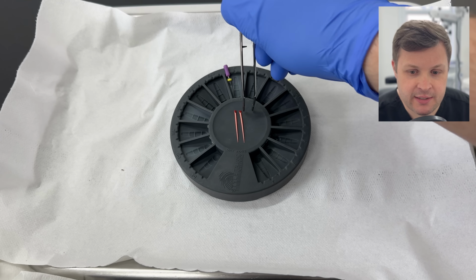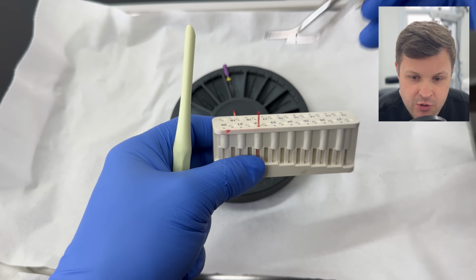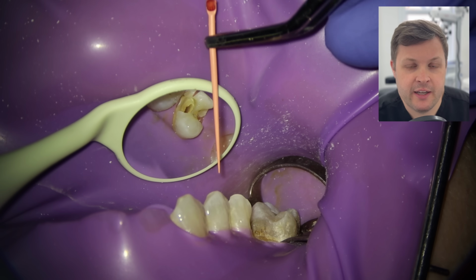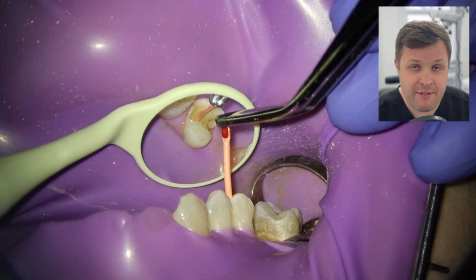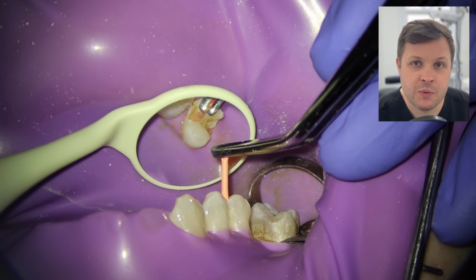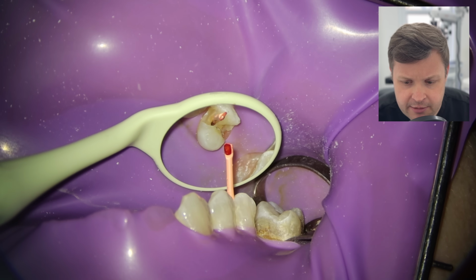And then we're going to pick up the cone. We're going to measure this cone 0.5 millimeters away from the 0 reading we found on the working length, which is about 22 millimeters. Then we fit this cone to length in the tooth, and we feel for that kind of tug back. Sometimes, if you've left a significant amount of tooth tissue in the coronal aspects of this tooth, this might grip onto the cone or even the file. So you've got to be careful that this is going to length really nicely.